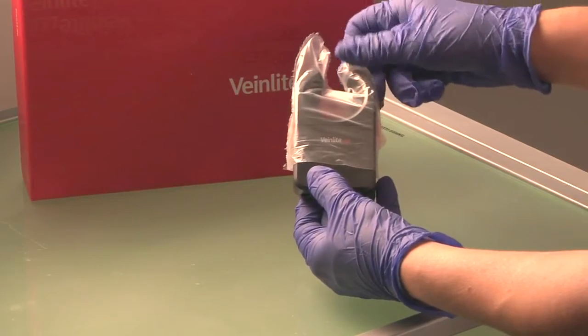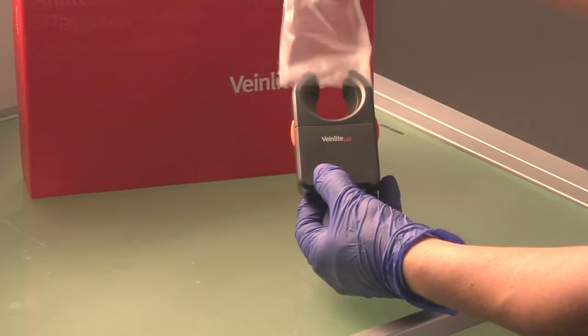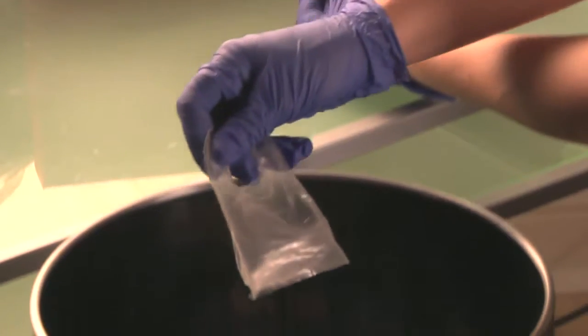Once your procedure is complete, remove the disposable plastic cover and discard it in the appropriate receptacle.